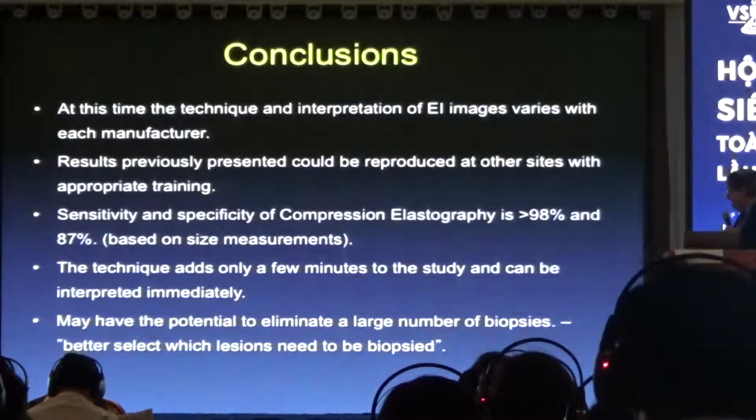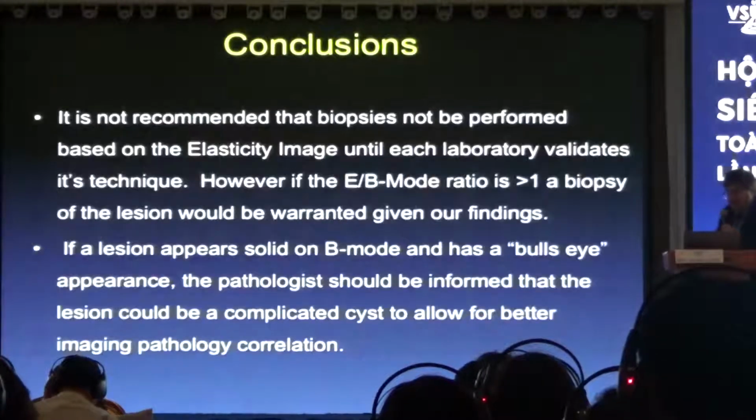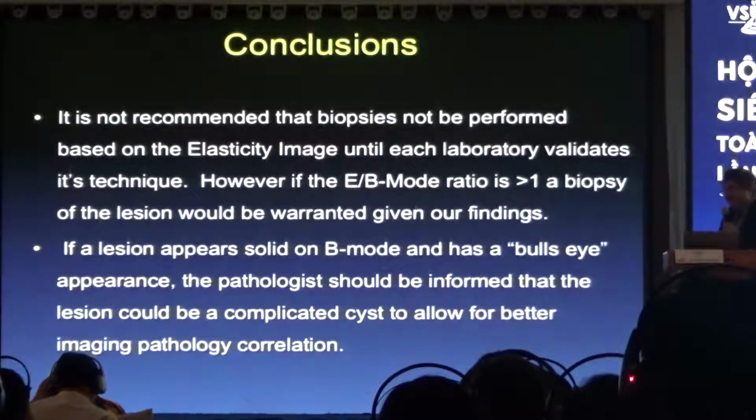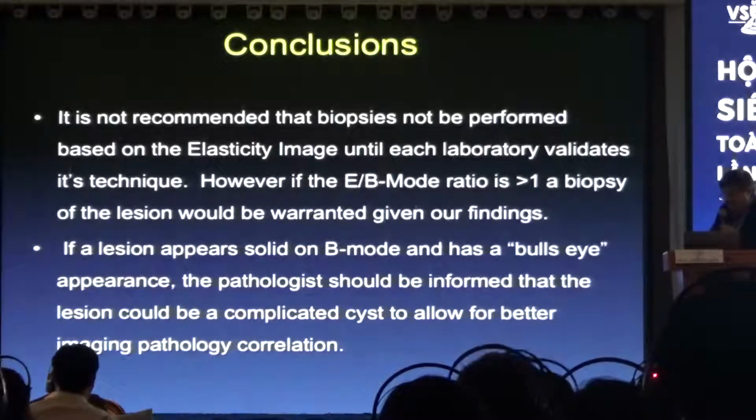And again, I like to say it better selects which lesions need to be biopsied. We've eliminated a large number of biopsies. And again, I would like to remind you that you have to feel comfortable with the technique and feel that you're doing good and confirm that you're doing good before you start canceling biopsies.